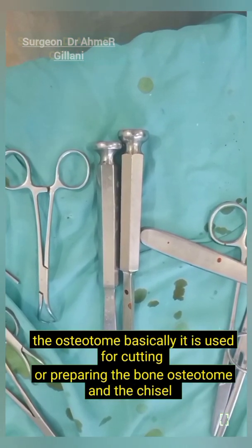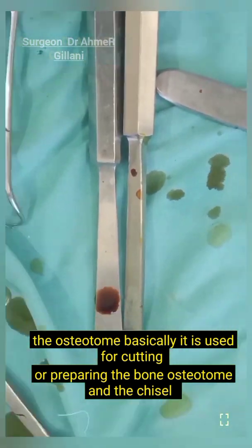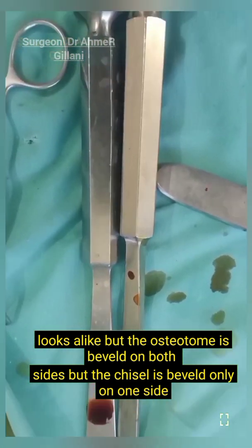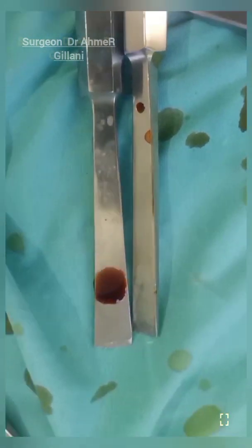The instrument you are seeing on the screen is basically the osteotome. It is used for cutting or preparing the bone. The osteotome and the chisel look alike, but the osteotome is beveled on both sides while the chisel is beveled on only one side.